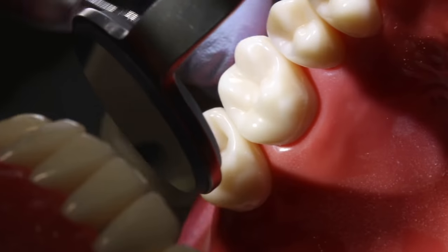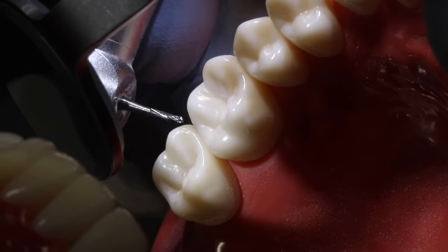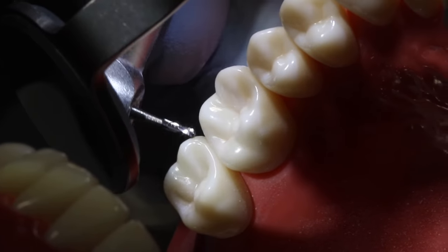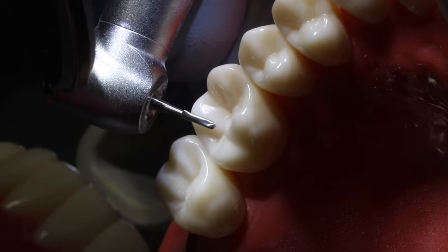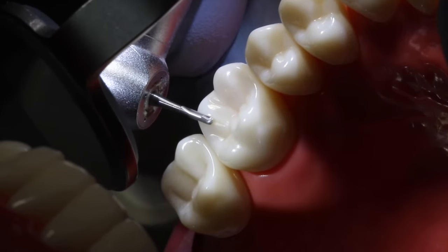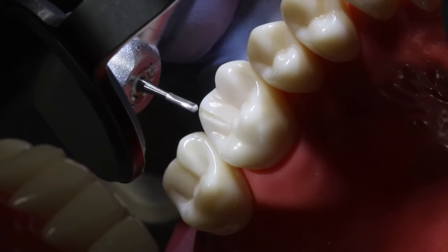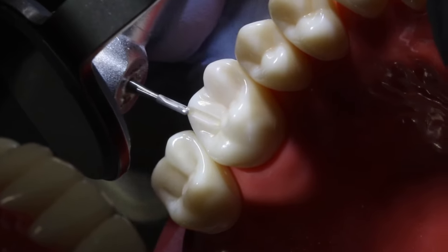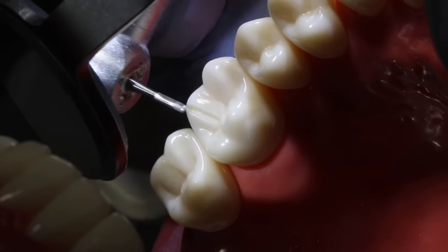So we'll start by placing a guide cut on the triangular ridge. It's actually the part of the oblique ridge on this upper molar. We'll parallel it with that triangular ridge. And this 1557 burr is a millimeter in diameter.